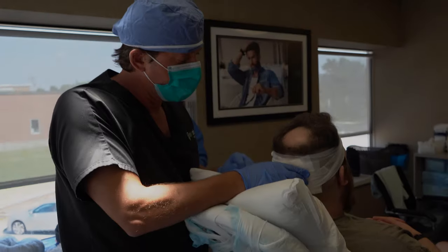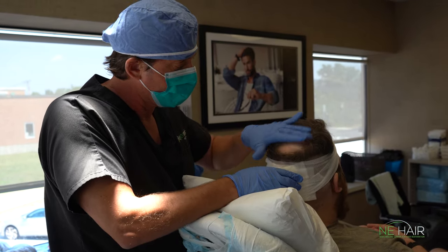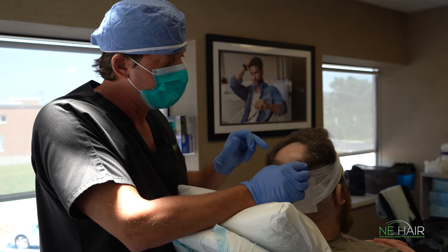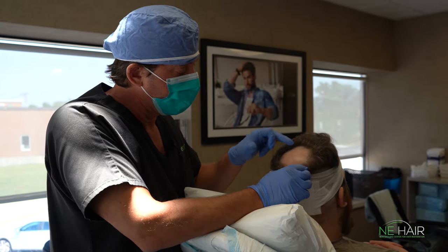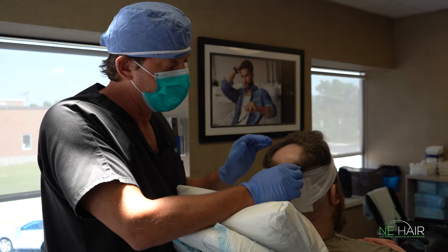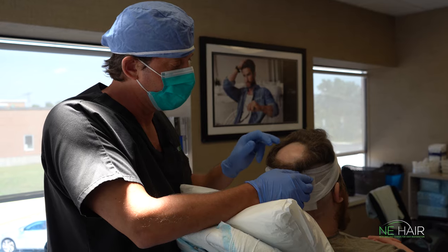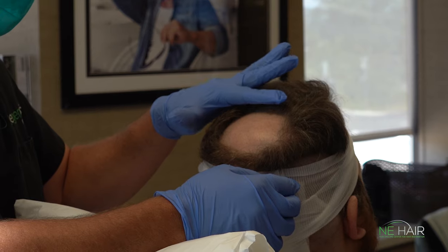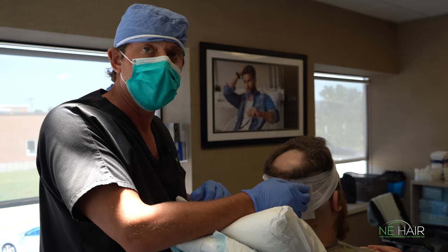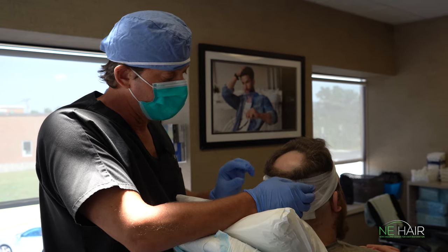We're going to be doing some crown work here today. We have a nice, well-defined, well-demarcated area to work with. We already shaved a little area so we don't see the vellus hairs, but there was a little bit of hair here before we started. We're going to numb that up. We have really great density going forward here, so we want to try to match that as best as possible.